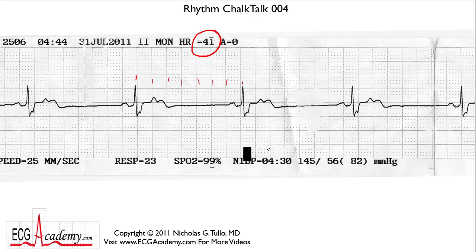Are there any P waves? We can see P waves — yes, indeed. If you look in front of the QRS complex, you see what looks like a normal P wave in front of every QRS. It's upright. The PR interval measures about 180 milliseconds or so. So that seems to be normal.